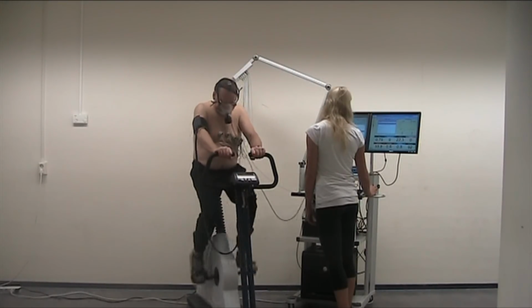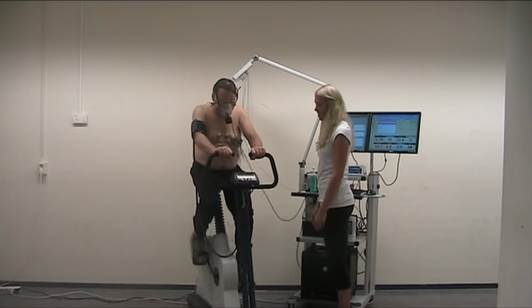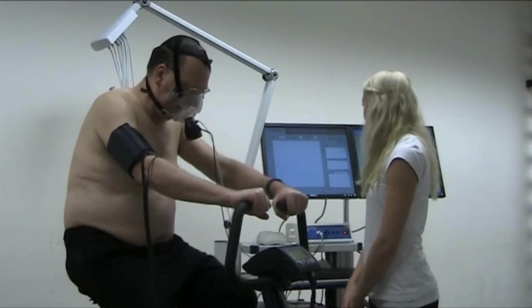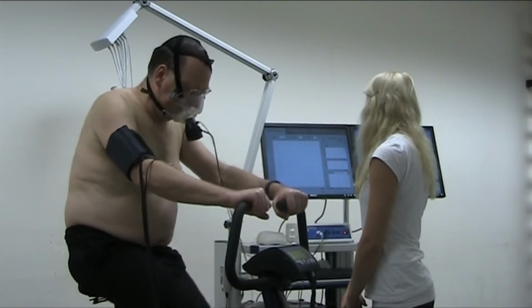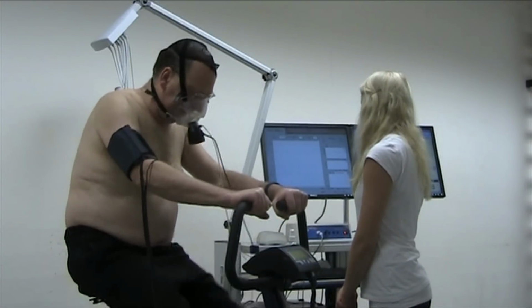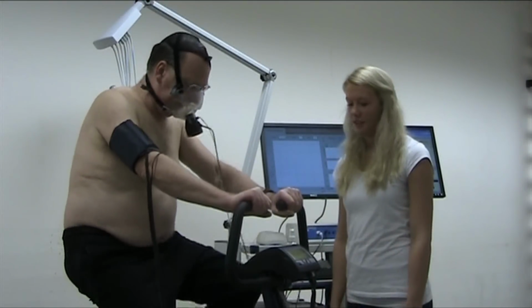The RER shows the respiratory exchange rate. Now you can see that it's at 0.82. The VCO2 box shows the production of CO2 breathed out by liters per minute. The VO2 box shows the consumption of O2 breathed in by liters per minute. If you look at the relationship between these 3 boxes, you can see that at the moment there's more O2 breathed in than CO2 breathed out, which makes the RER less than 1.